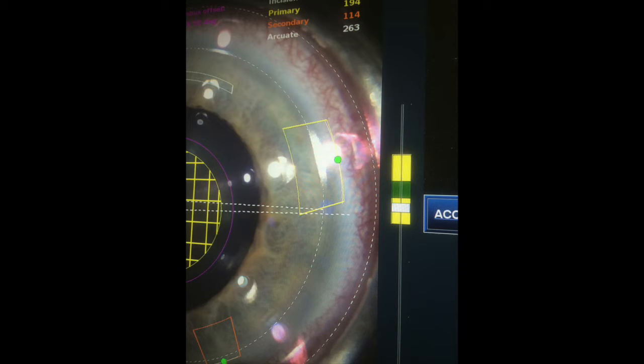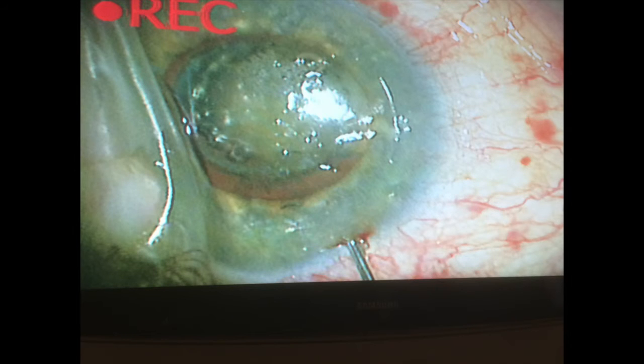Here's a case. I just wanted to point out that there can be a disconnect between the visual representation on the screen. Here it looks like that incision's all the way into the conjunctival blood vessels, and the actual surgical result, which is here, is at a perfect location at the limbus. So it's very important, again, to visualize things through OCT imaging.